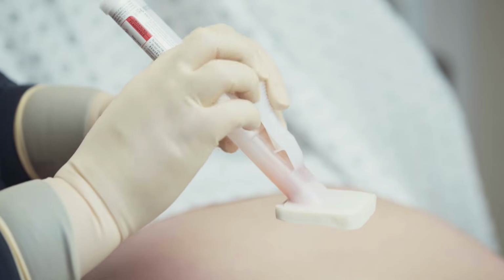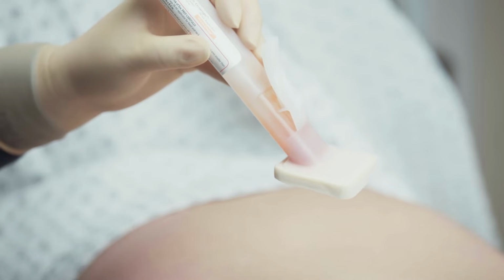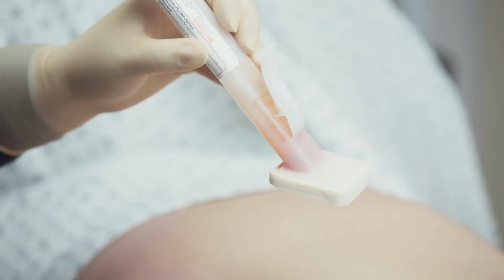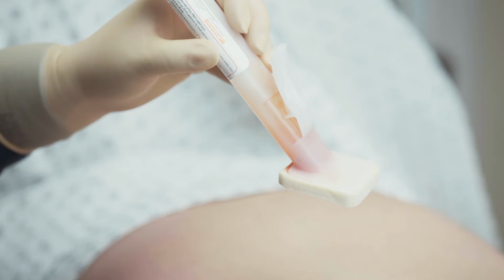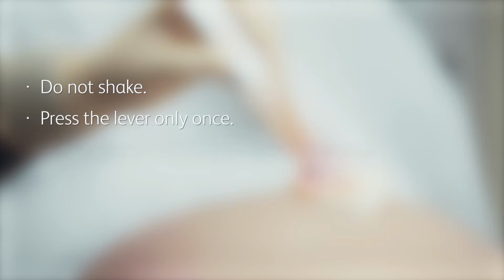Using your thumb, simply press the lever only once to activate the applicator, releasing the antiseptic. Release the lever and allow time for the solution to partially load into the sponge. The applicator's unique design controls the flow of the solution for smooth delivery. Do not shake or press the lever multiple times. It may be necessary to use two hands to press the lever.